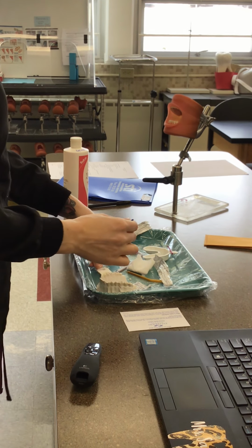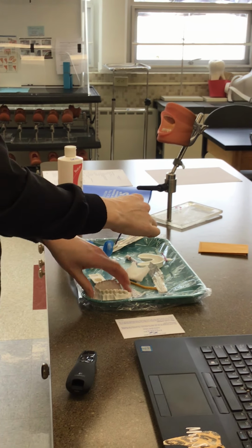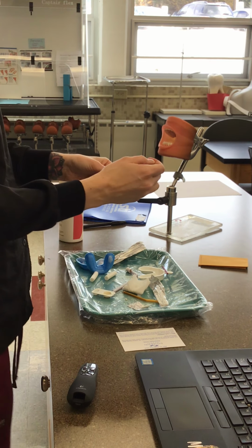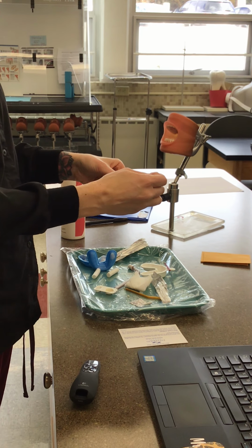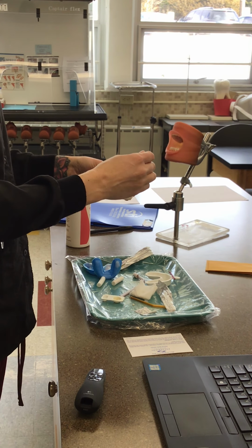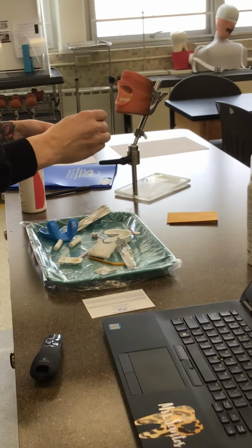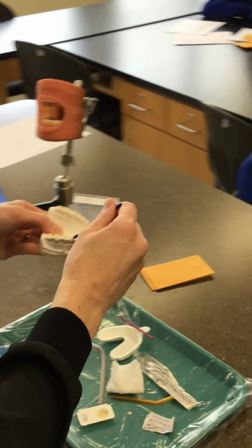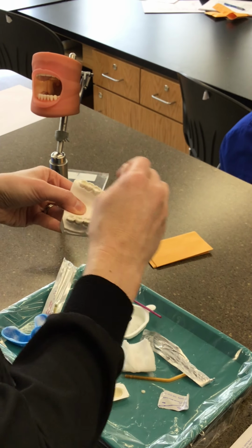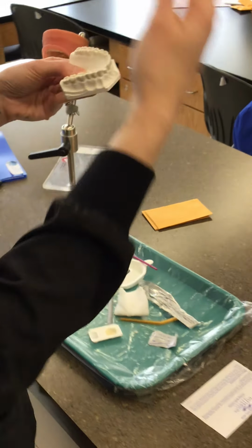The way that the manufacturers recommend you apply it is basically in two swooping motions. So you have a patient in, they're open, you're gonna take the buccal cusp, run along it, and it's gonna flow down, okay? And then you're gonna do the lingual cusp and allow it to flow down. So you might have them open and go buccal cusp all the way around, okay? And then lingual cusp all the way around, or you can do it in quadrants, as you need, depending on how much is flowing down.